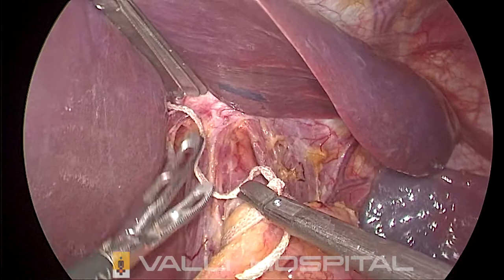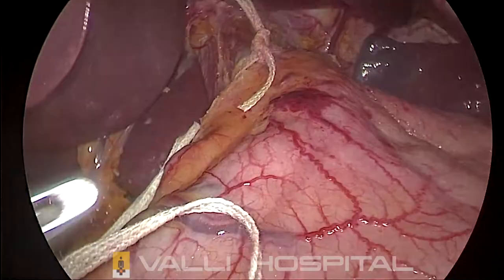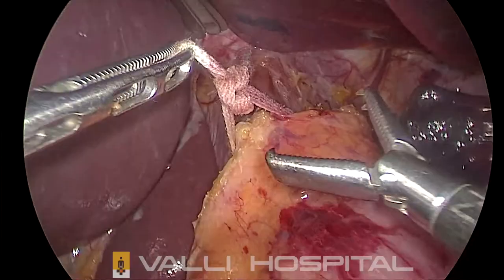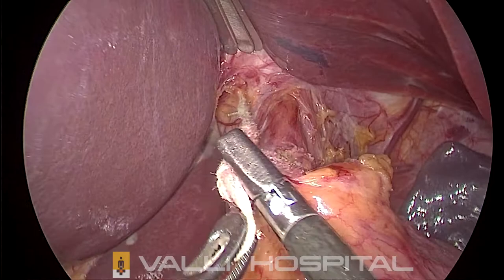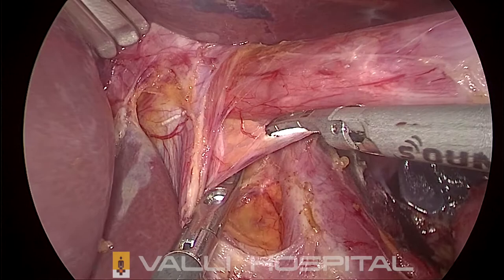When the suture material comes in, there will be a lot of disturbance. So cut it short. Remove it immediately. Through the 5mm instrument it will come. Then take a tooth grasper or a needle holder, insert it underneath the knot and then hold it. This will have a very good grip. Now you can move the esophagus left, right, anterior, posterior, and you can dissect. You can get into the mediastinum very easily.